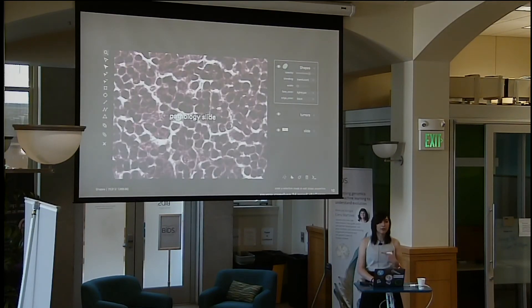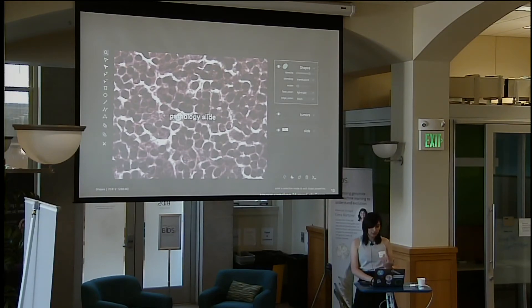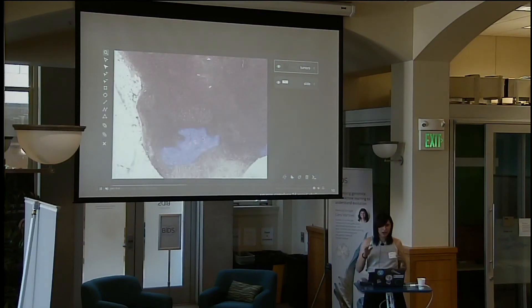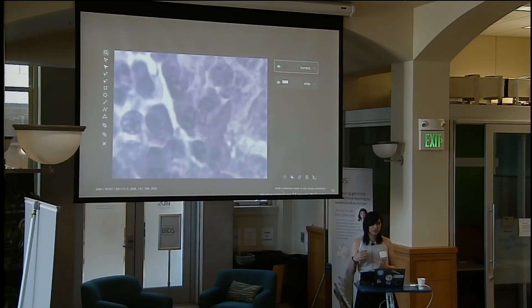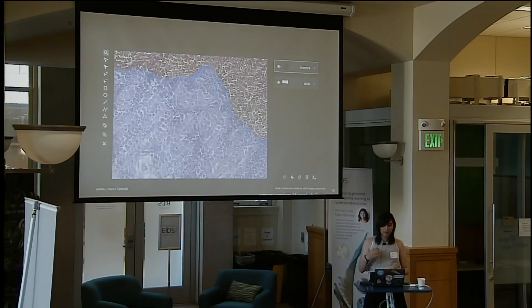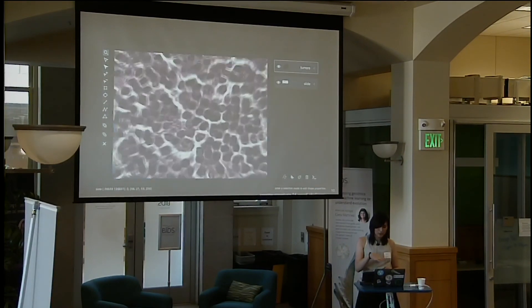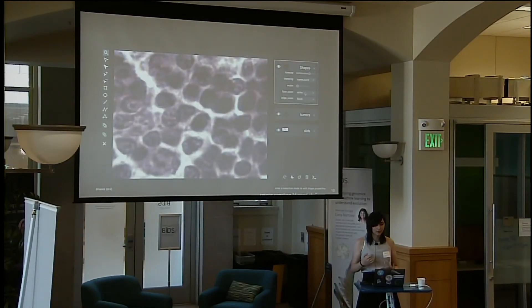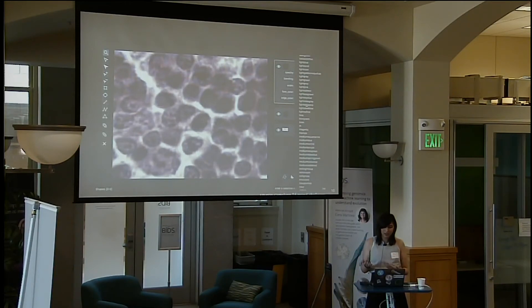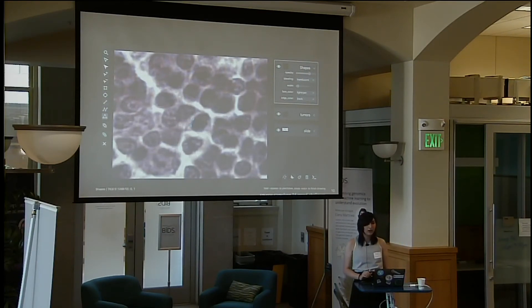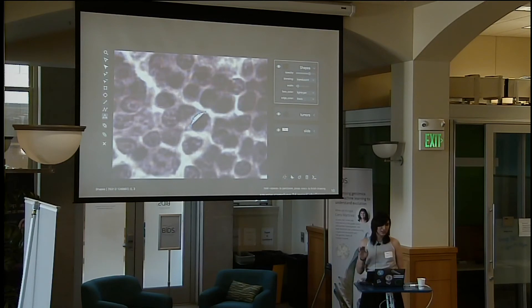Here is a pathology slide taken from the Camelyon 16 Grand Challenge. It's about 100,000 by 200,000 pixels in size. There are 10 levels to this pyramid. As you can see, as we zoom in and out we're loading up the different resolutions of this image, leveraging Dask. This dataset is about 20 gigabytes in size. You can see here we are labeling a cell using a shapes layer.